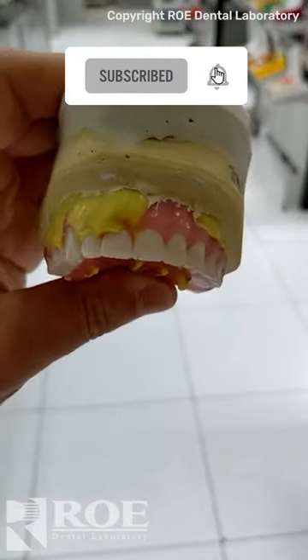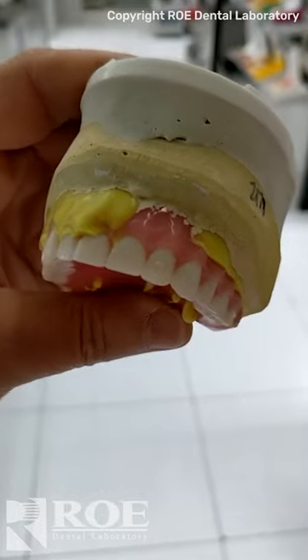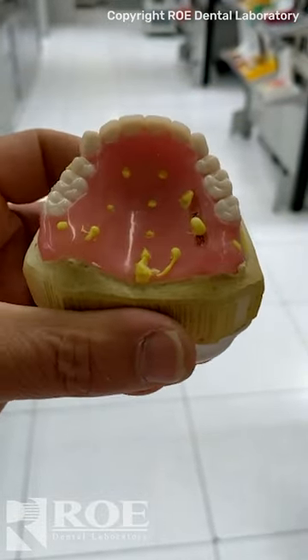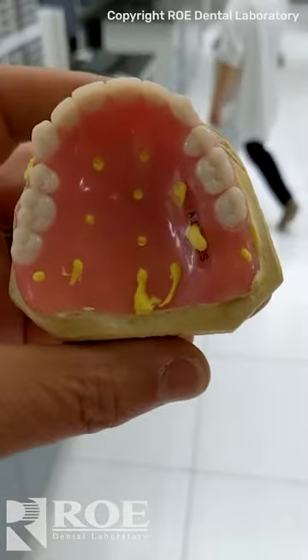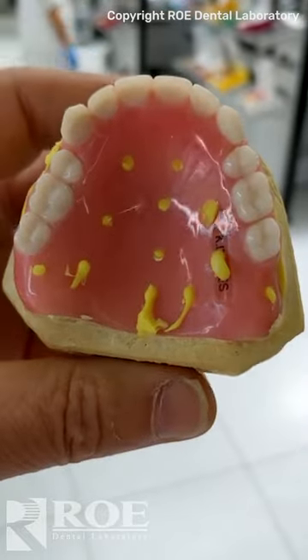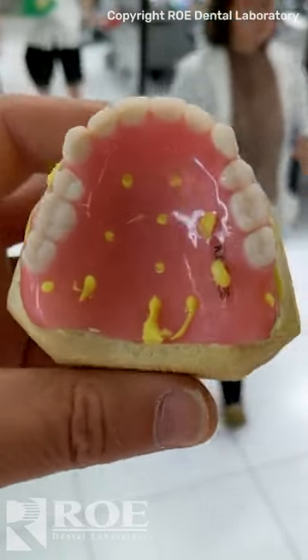What do you do when your digital denture just does not fit — or analog for that matter — or you do a wash? Well, here's a neat technique that a local doctor does: drills holes through the palatal area, loads it up with light body or medium body depending on how off the fit was, and then you know that there are no voids under that denture.